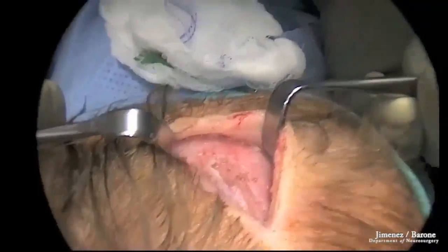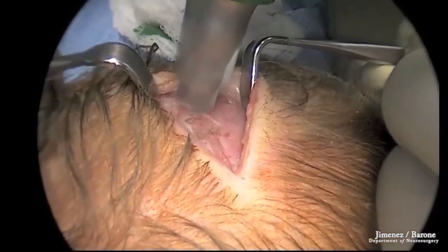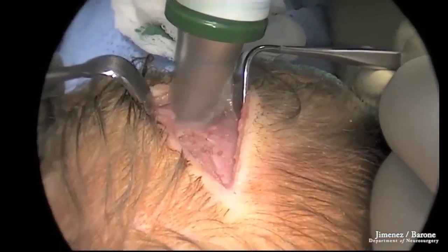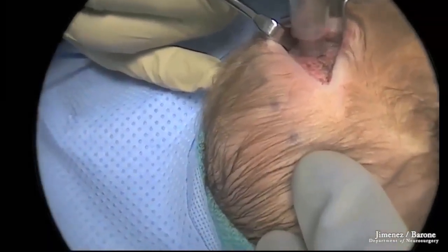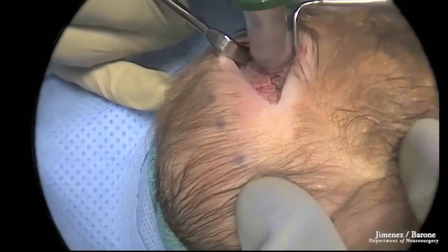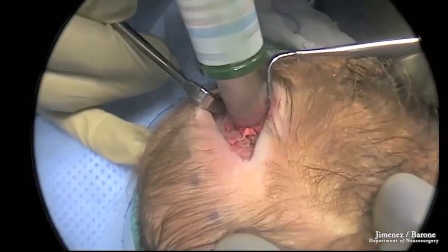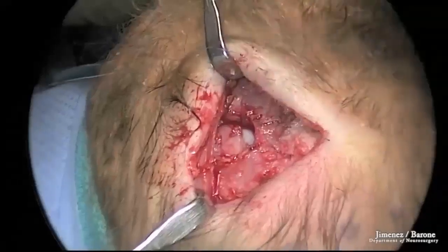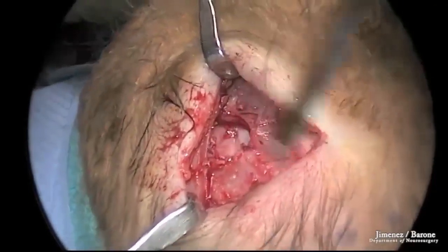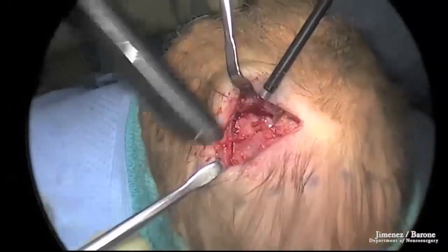The osteotomies are done first by placing a single 7 mm burr hole on the right side of each incision and then developing the osteotomy with Kerrison rongeurs. Number 1 Penfield is used to free the bone from the underlying dura across the sagittal sinus. Here we can see a 5 mm Kerrison being used to make the osteotomy in the posterior incision.